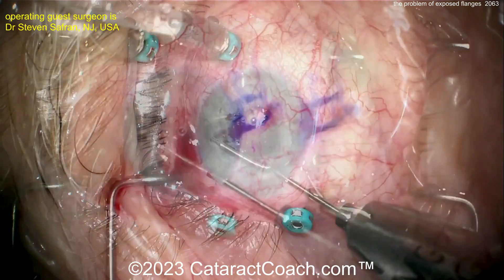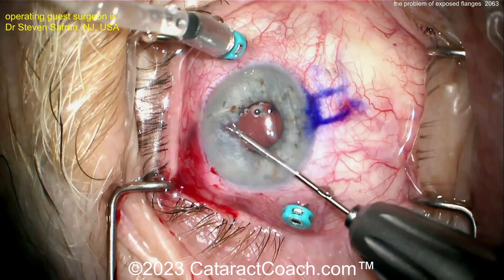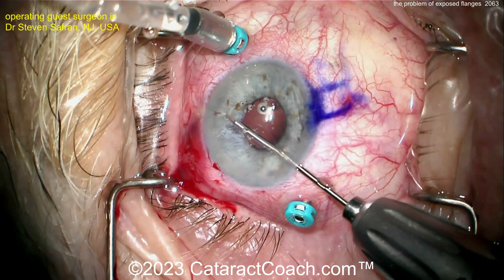Now to address the iris, he's going to pull it out of the incarcerated area, get that freed up, and you're going to have to do some pupilloplasty in this case.